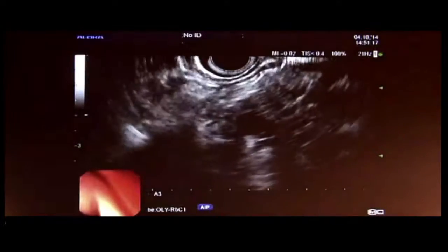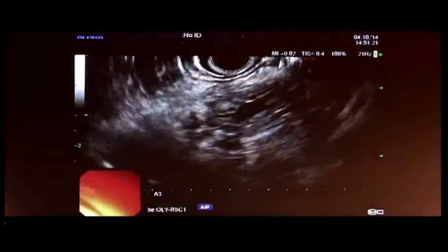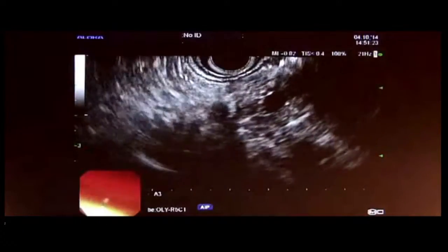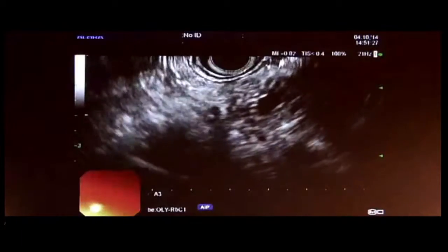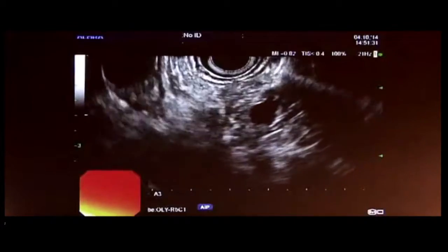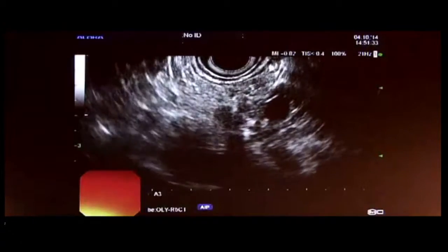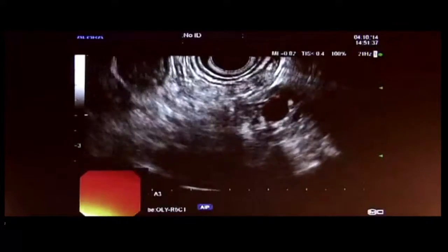The other thing that's very helpful is to have an assistant, somebody hold the scope, because the scope wants to displace as well. Recoil backwards, all right? So I'm just going to hold this position. You got some breathing movement, right? And I just thrust it, but I missed it. So I'm going to readjust. Okay, and at least I know what the trajectory is.